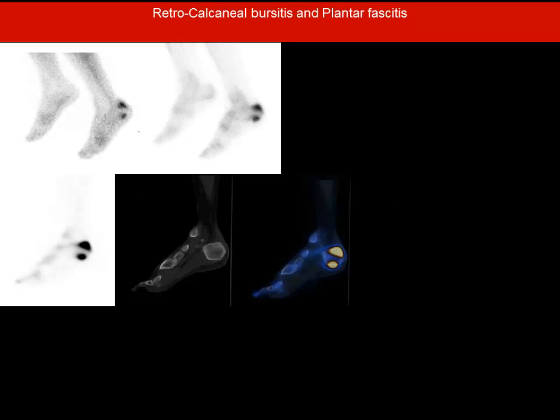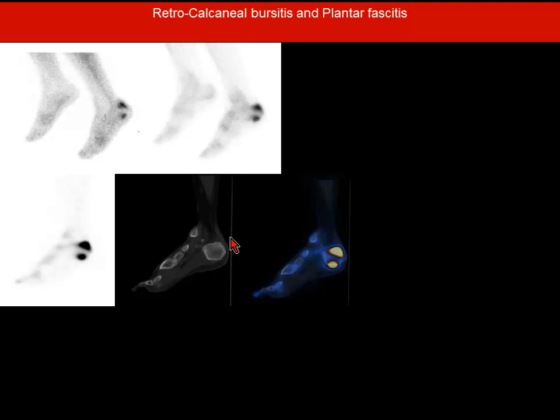Another patient with pain in the foot. It is a two-phase bone scan showing two focal areas of increased tracer uptake. Without hybrid imaging, one could have been called Achilles tendonitis and the second plantar fasciitis. However, there are bursas close to this area — the retrocalcaneal and retroachilleal bursas. In this case the diagnosis was plantar fasciitis with retroachilleal bursitis.